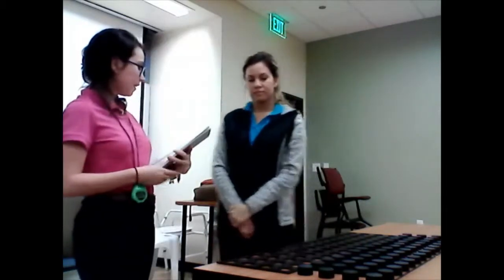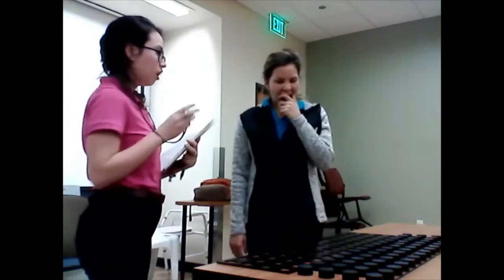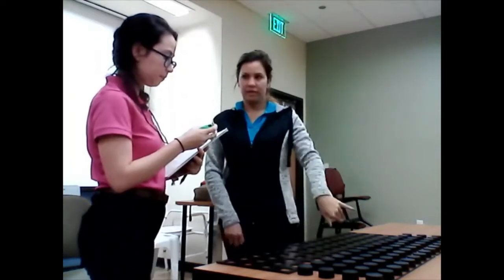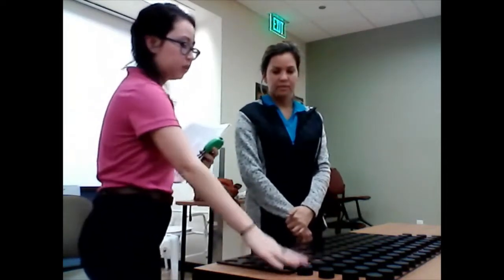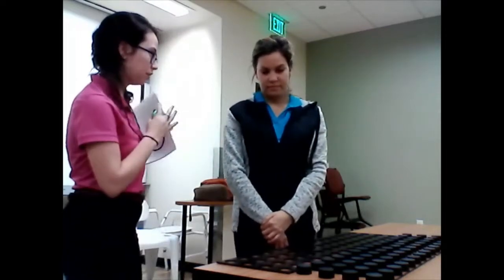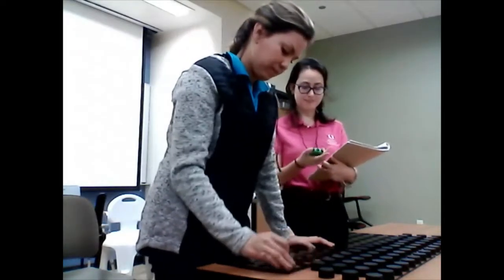The object of this test is to see how fast you can put the blocks back into the holes, bottom side up, with one hand. Are there any confusions on this assessment? The whole thing, right? Yes. Okay. I'm going to count to 3, and you're going to place your hand on this peg and begin. Remember to do it as fast as you can, just like with every other assessment. 1, 2, 3.